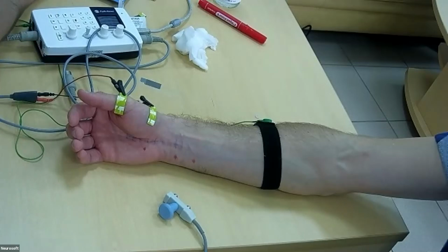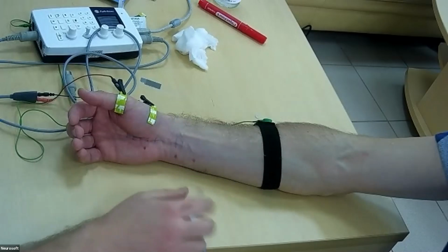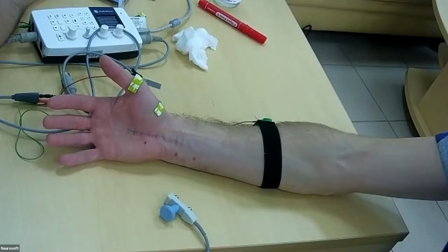Now we set electrodes, ground in the same place. We already have a scale, so we will use almost the same scale for motor inching.